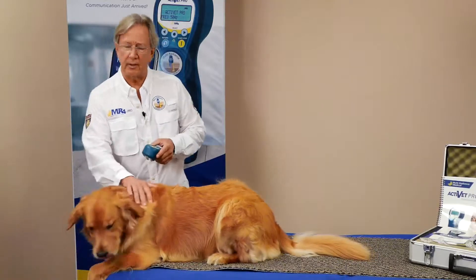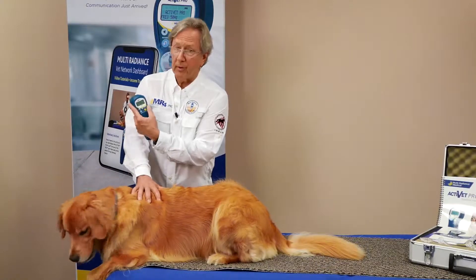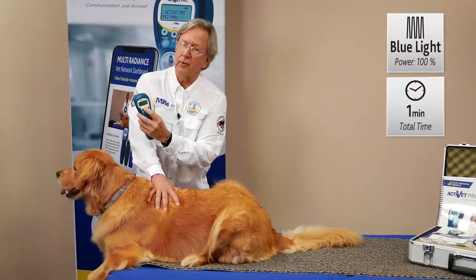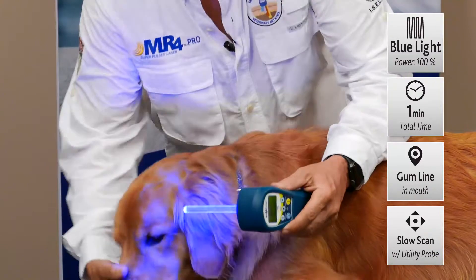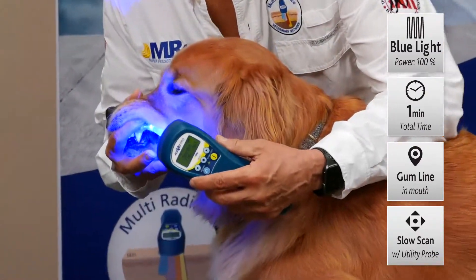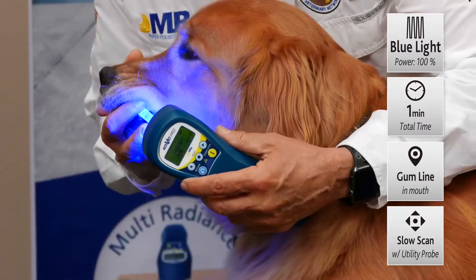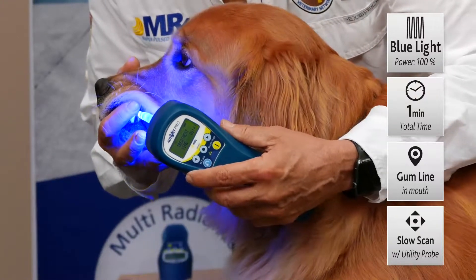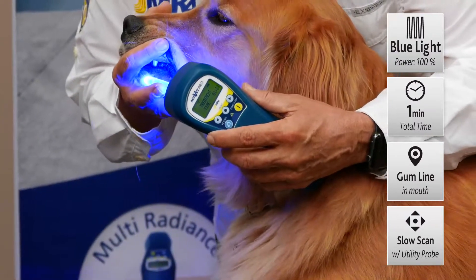Now if there happens to be infection there as well, it's a good idea to just hit stop, come back to the Activet Pro setting, bump that over to the blue mode, press select, take it up to a full hundred percent, and do another minute with the blue. Then just repeat and come right along the gum line with the blue radiance. It's very effective against infection, even MRSA — it causes oxidative stress and those bacteria just die. You'll really be impressed with how much faster these conditions resolve when using laser therapy along with this very special blue wavelength.